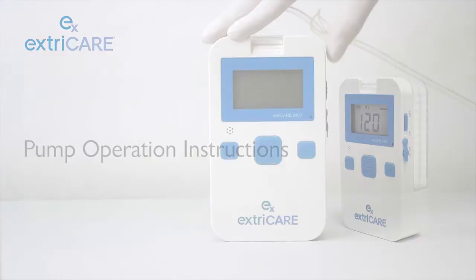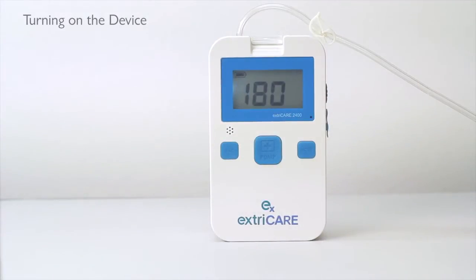To use the pump, push the ON-OFF switch to the ON position. You will see it count down over the next 5 seconds.